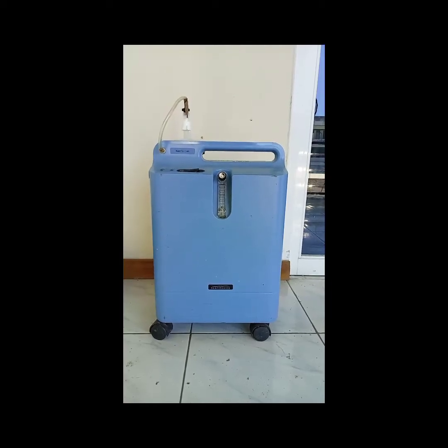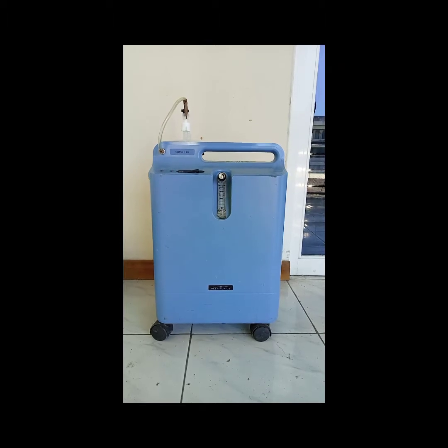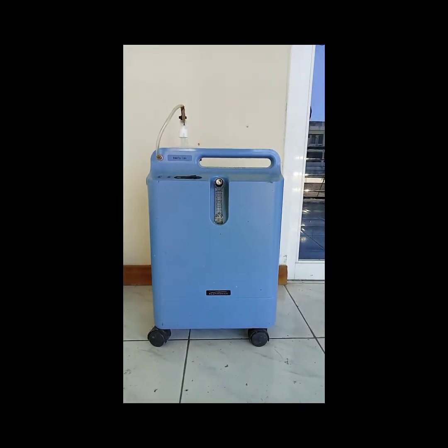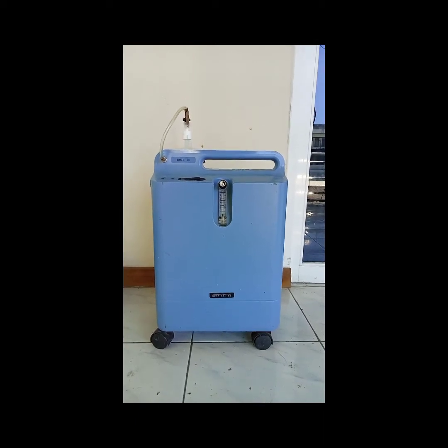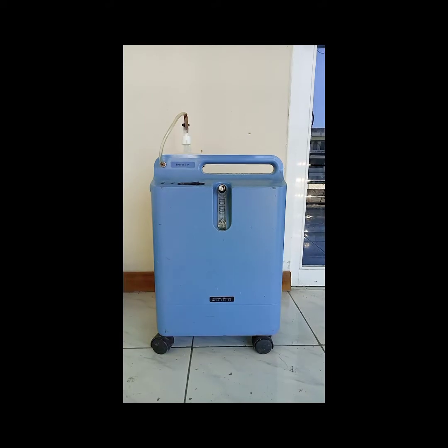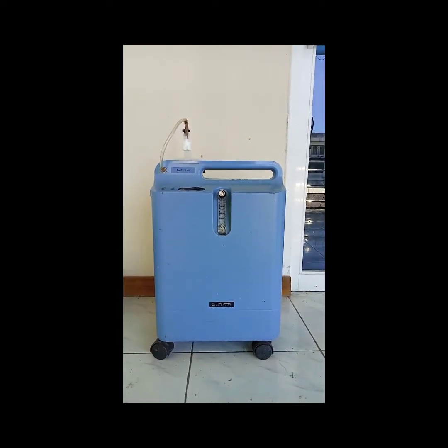Once again, Biomed, good day. I have here an oxygen concentrator from Pyronix Everflow. The problem with this one is within 30 minutes of operation it will alarm, and there's a faulty indicator, so we're going to check what's inside and see what the culprit is.